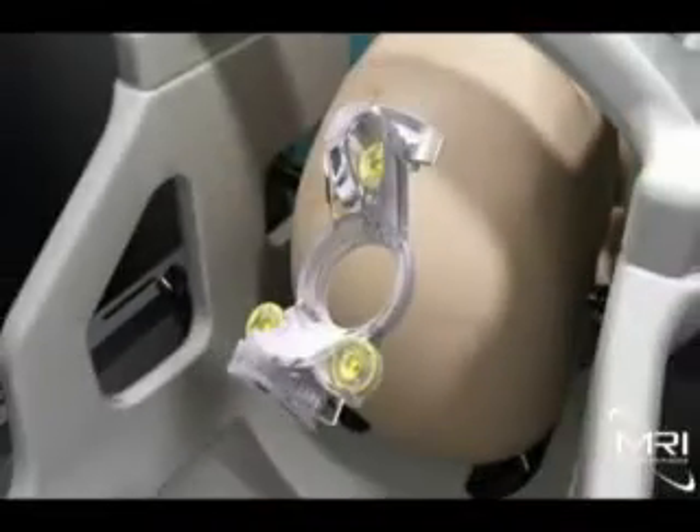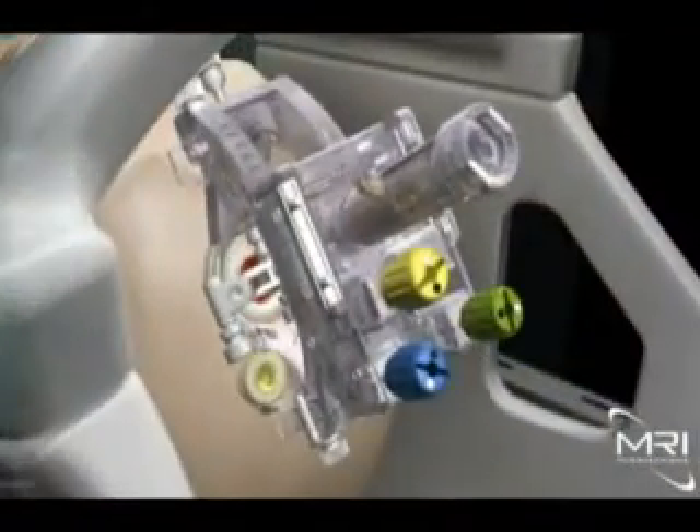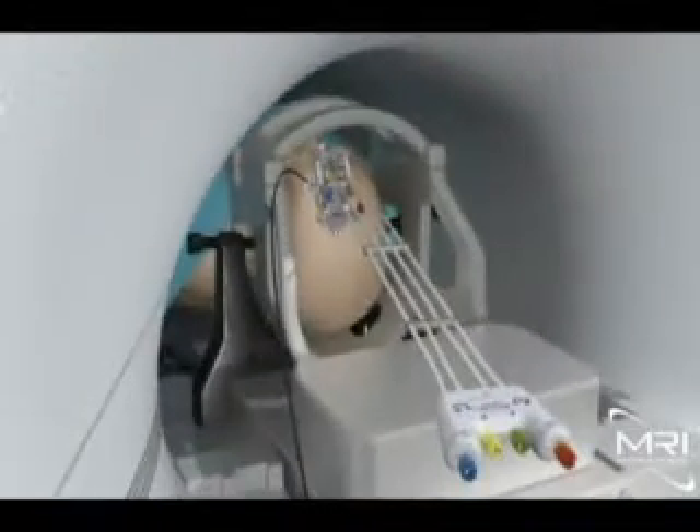After a small burr hole has been created, the surgeon affixes the base portion of the smart frame to the patient's skull. The tower of the smart frame is then attached to the base. The color-coded hand controller is then attached to the tower.